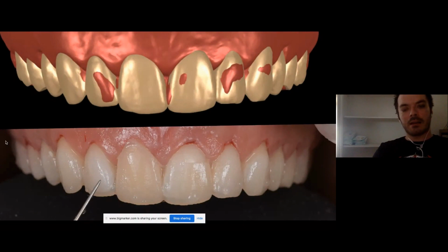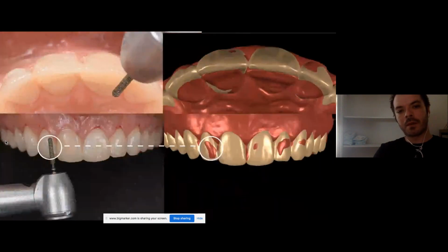So the second question would be, if I make the final design, because you can go very fast to the ideal design, how do you know how much to reduce before you can transfer it in? Long story short, this slide here says it all.